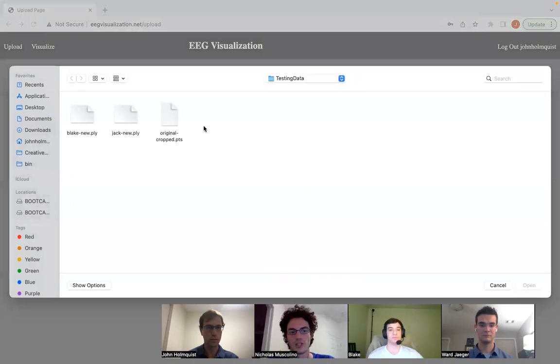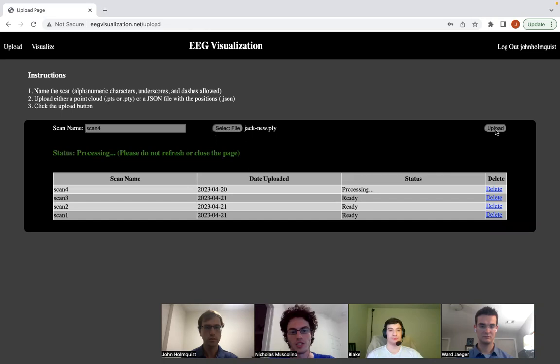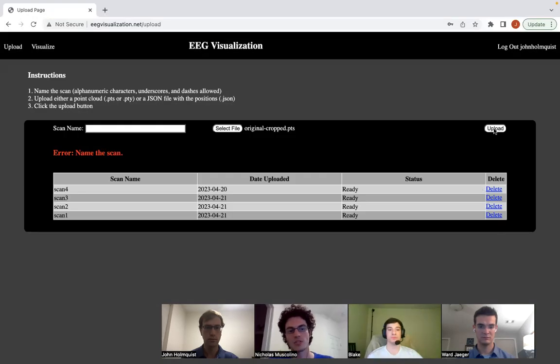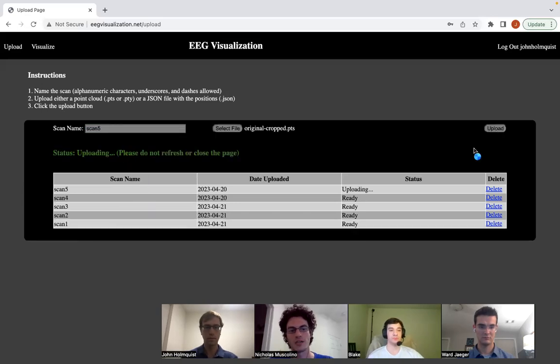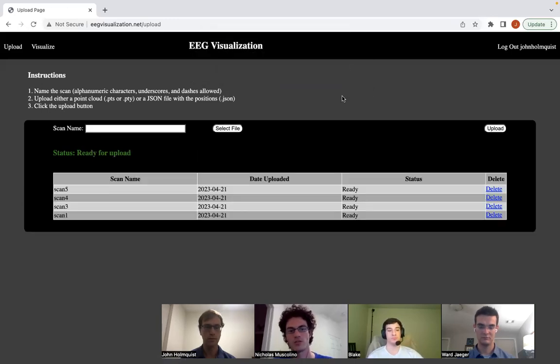In addition to the user information, we also store all the information related to scans, being the scan name, the date the scan was uploaded, all of the electrode coordinates that we determine and save in a JSON format, as well as the user who uploaded the scans. And the reason for that last one is so that only the current logged in user can see their own scans. One of the challenges of doing all this is that I had never worked with a SQLite database using both Django and JavaScript to update the table. And so it was really interesting and challenging working through that learning curve.